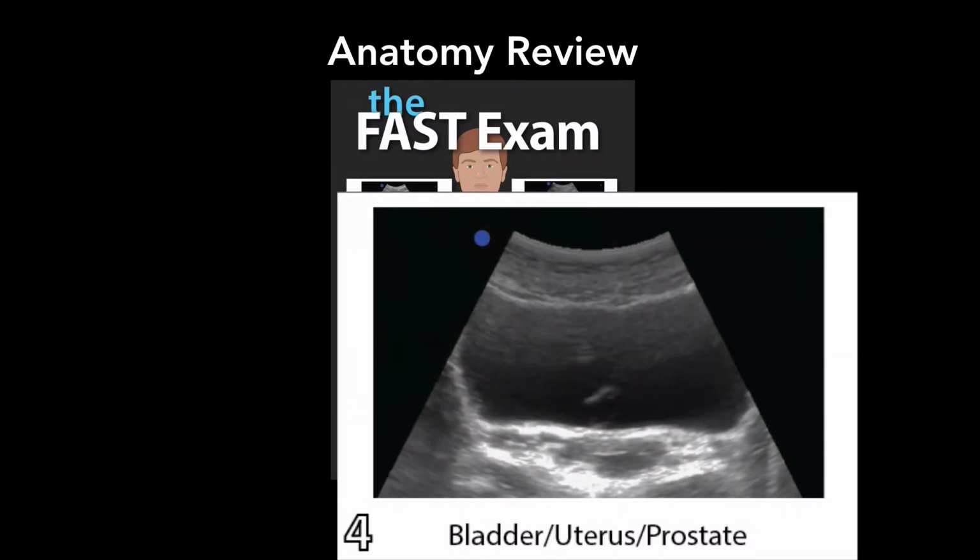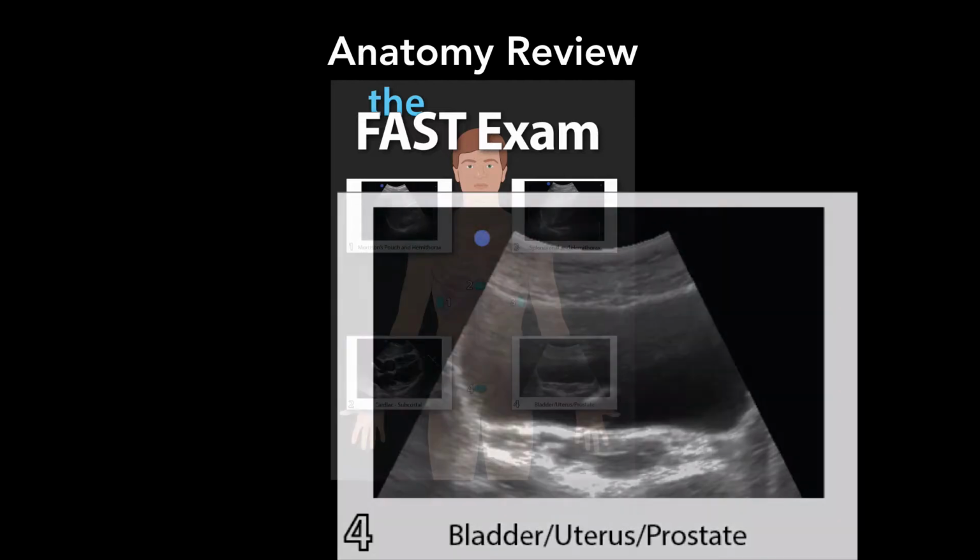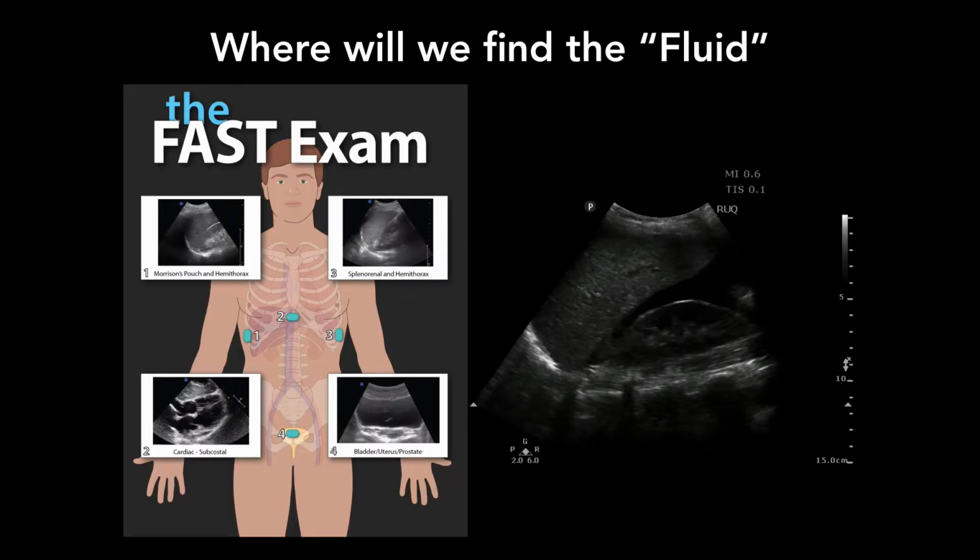And then the last view is down into the pelvis. Remember, we look for the bladder, right? The bladder is not free fluid, it's a contained fluid, but it's our window to see posterior. And so we see either the uterus or the vagina or the prostate, depending, right? So where will the fluid be, all right?